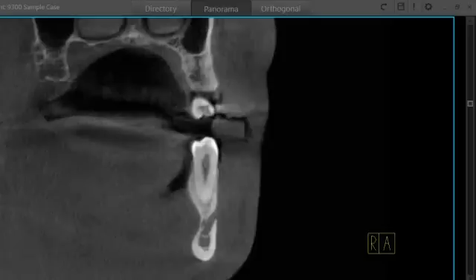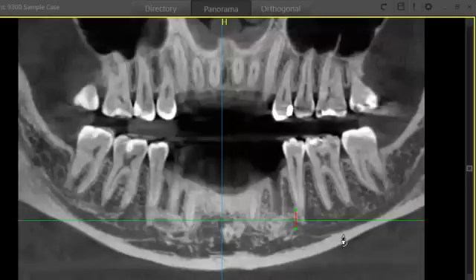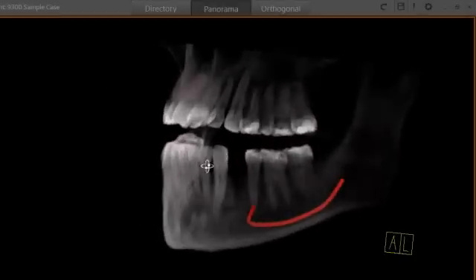I'm going to select my nerve drawing tool and place my points. Then we'll jump back to the pan up here and finish the nerve mapping out. And we're finished. If you want, you can jump over to your 3D volume real quick just to take a good look.